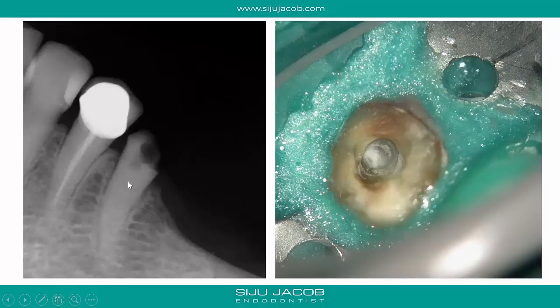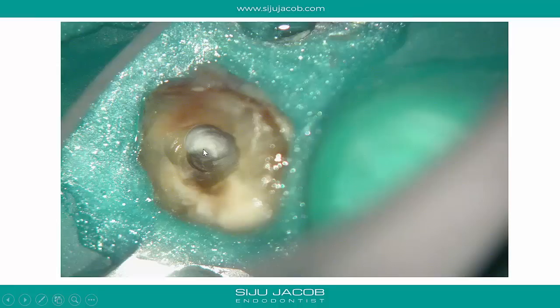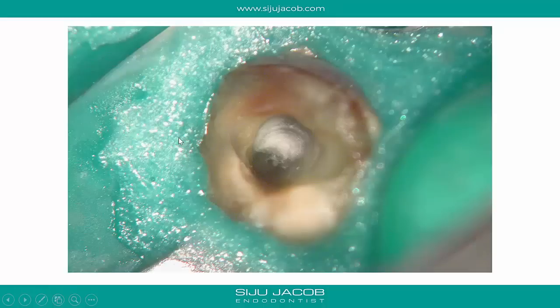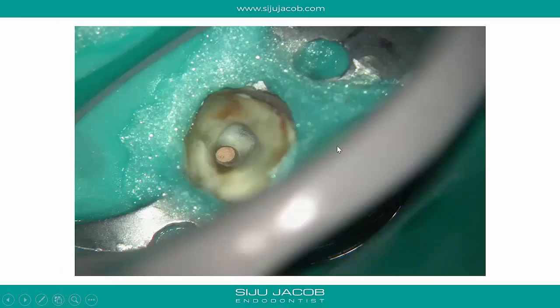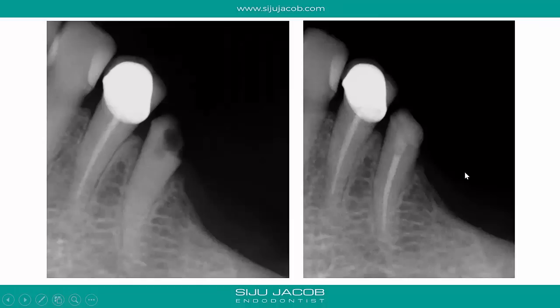This is another case with a crown-prepped tooth — naturally people tend to lose orientation after crown preparation. The clinician made an access that appears to be in the middle of the tooth, but under the microscope we see a very bright area where the access was made and a darker area elsewhere. We do not look for the canal in the bright area — that heads toward perforation. We stick to the darker area and drill down, and sure enough that's where we found the canal. The canal was skewed to one side because the tooth had been crown-prepped.